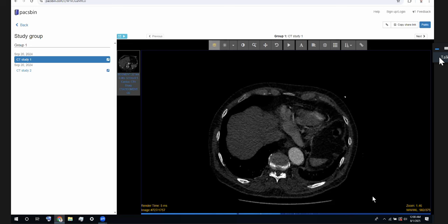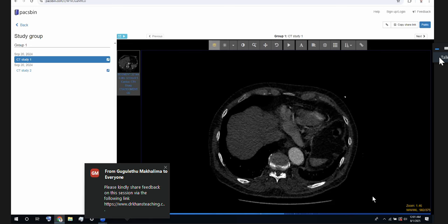You can look for things like end organ ischemia if you think there's compromise to the blood supply. These are just things to get extra points on the scan.